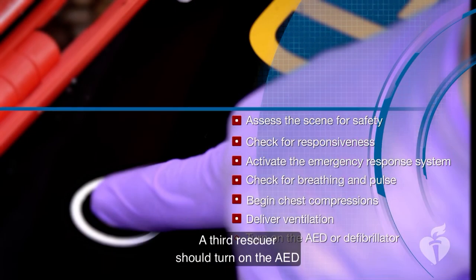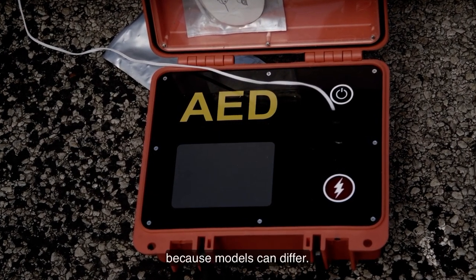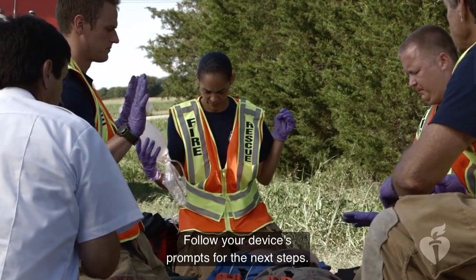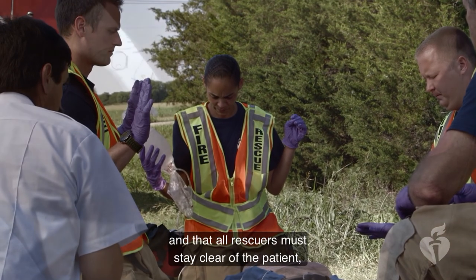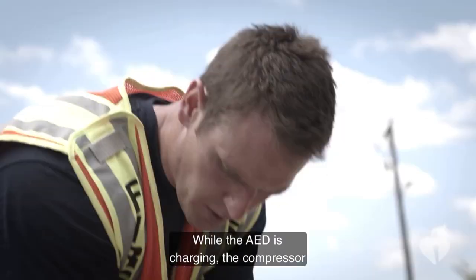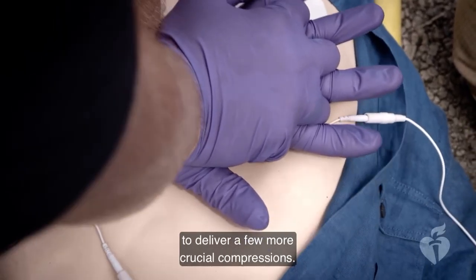A third rescuer should turn on the AED and attach the pads to the victim's bare chest. It's important to know your AED or defibrillator because models can differ. Follow your device's prompts for the next steps. When the AED signals that it's ready to analyze and that all rescuers must stay clear of the patient, the compressor should switch roles with another rescuer. While the AED is charging, the compressor should take advantage of that time to deliver a few more crucial compressions.